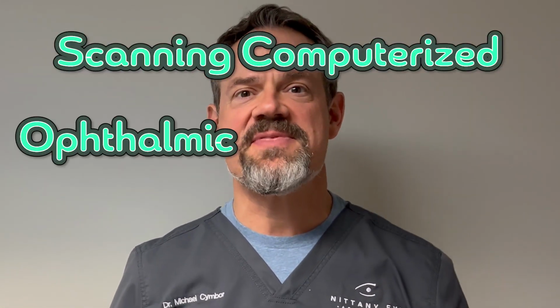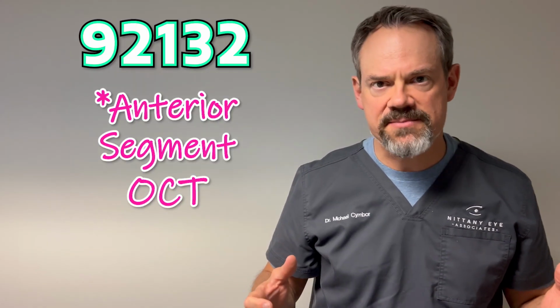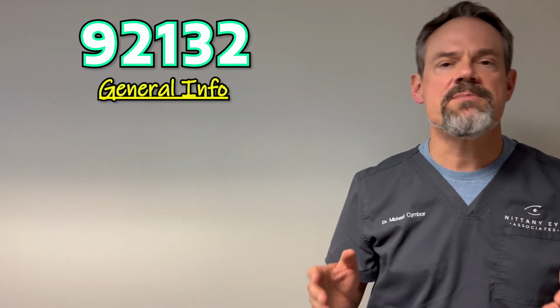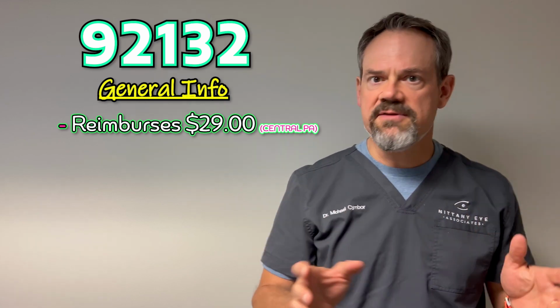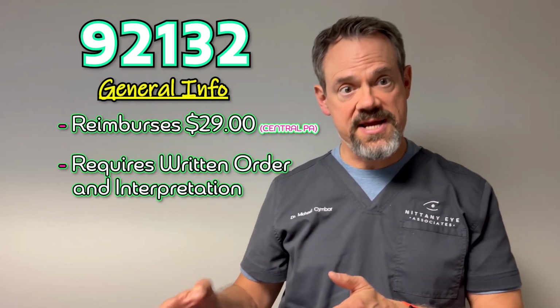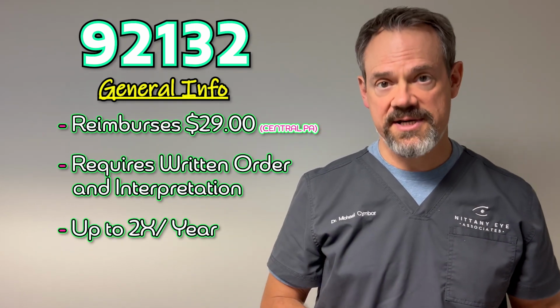Today's code is 92132, which stands for Scanning Computerized Ophthalmic Diagnostic Imaging. We know it as anterior segment OCT most of the time. So for this code, it reimburses about $29 in central Pennsylvania. As with all of these codes, it requires a written order and interpretation. The frequency can be up to 2 times per year.